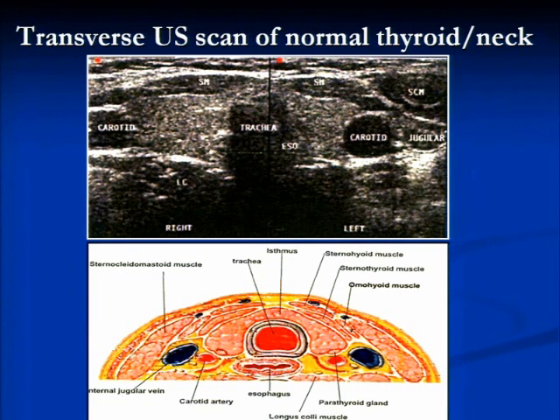thyroid, although if you have a hypoechoic thyroid gland, it can be difficult, as you'll see in the advanced section of this presentation. It can be difficult to distinguish muscles from lymph nodes in the neck once the thyroid has been removed, and we're doing follow-up ultrasonography for patients with locally metastatic thyroid cancer.